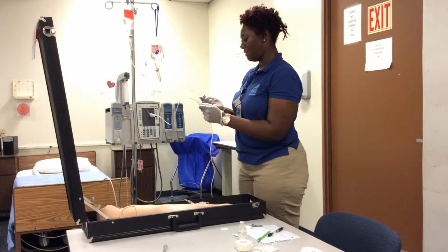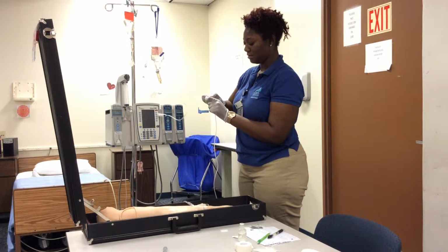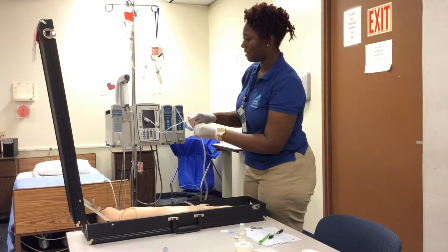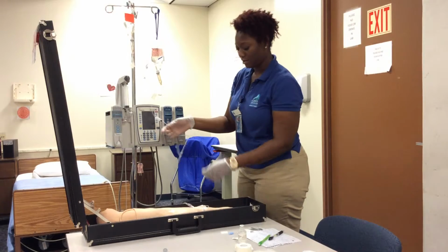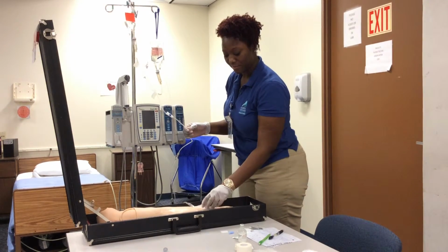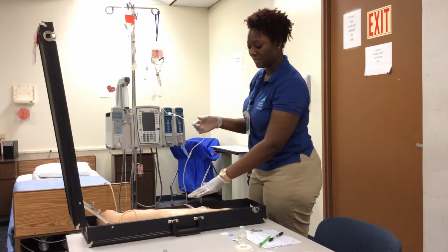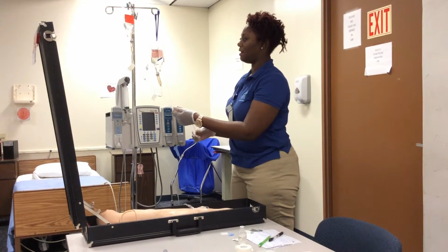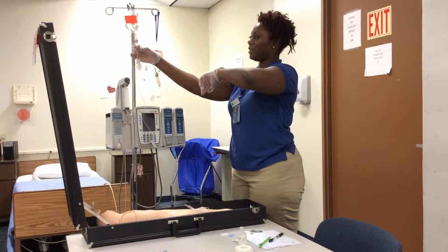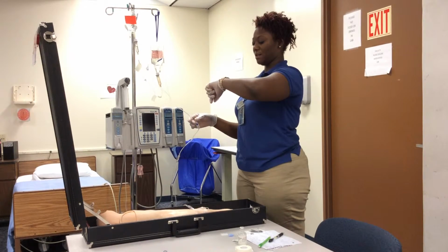I'm going to clamp off the primary. Push this on, and then turn on my secondary. And this clip will be on already, assuming that the primary is already running. Okay, good. Now I'm going to establish my drop rate, and it should be 33 drops per minute.